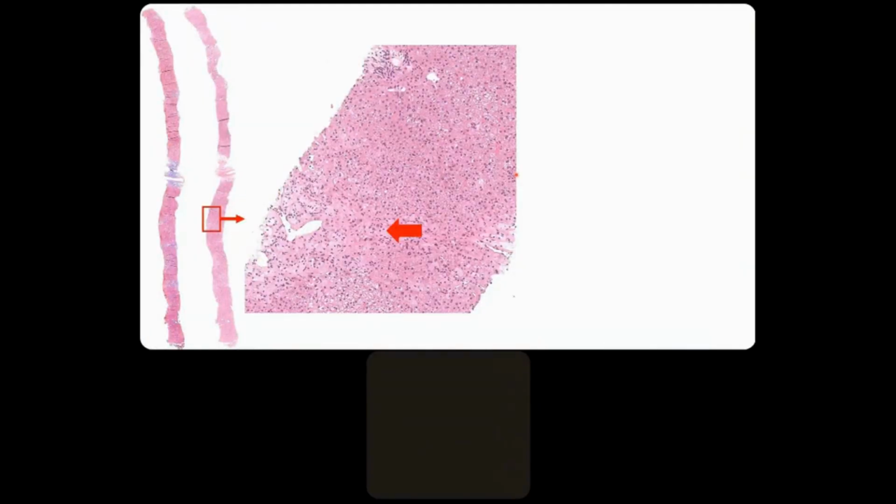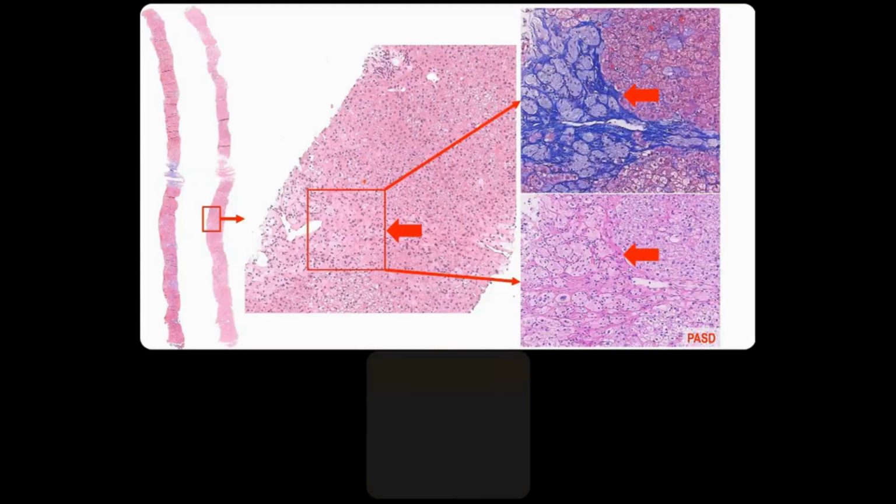Here is the last case example of a metabolic liver disease that I wanted to present at today's session. Clinically, the patient presented with thrombocytopenia, hepatosplenomegaly, and portal hypertension. The trichrome stain here on the left-hand side shows preserved liver architecture without cirrhosis. However, on the H&E, you can see at higher magnification the presence of these pale staining cells infiltrating through the liver, which is obviously an abnormal finding.